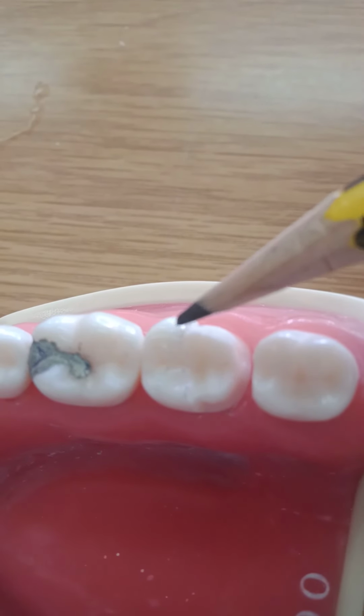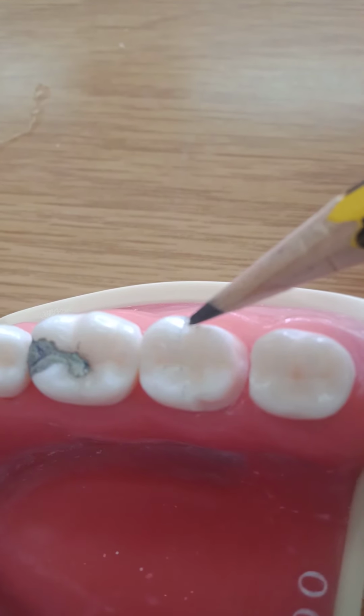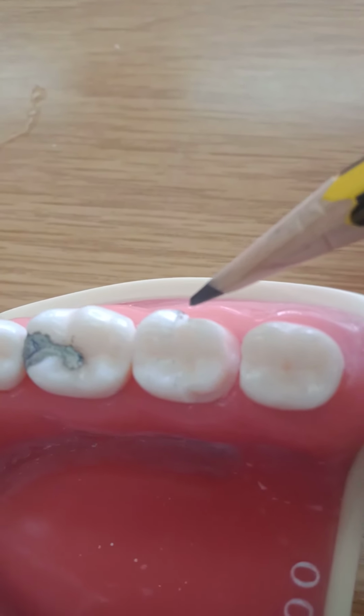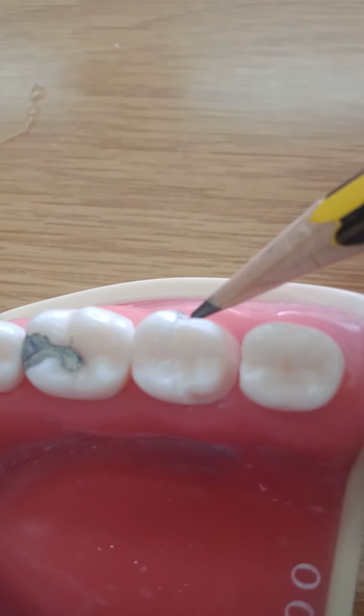But just to tell you, here we have to cross the middle. Why? Because you have to cross it a bit more, since this is where we want to place our resistance groove. We said that partial coverage crowns need something to strengthen them and create the resistance form. So I want to place a groove here. The groove is usually placed in the middle.